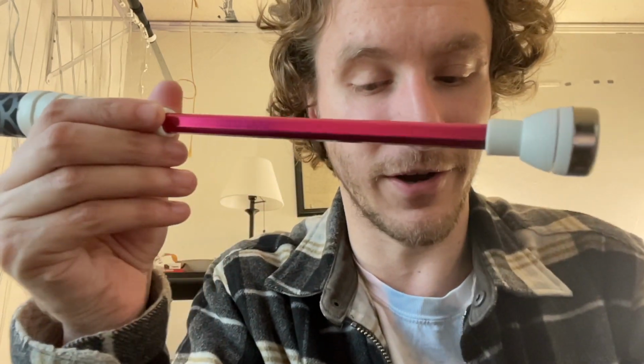So when it comes to telescoping canes, one of the biggest frustrations for a lot of folks is that as you're walking, I can demonstrate this with part of this cane, and then I can get into why it's fun in a minute. But if I pull this section out right here, and we'll get to why it's different, everybody calm down. If I'm walking, I'm going to put my hand in front of me as a barrier, as a bump to bump into, and a traditional telescoping cane will hit a particularly uneven surface and collapse. It's really frustrating because then you have to readjust your cane before you resume walking. It's exhausting, and it just is inconvenient, especially if you're a fast traveler or if you're in an urban environment where you're catching a train, catching a bus, navigating a busy intersection and your cane collapses on you.